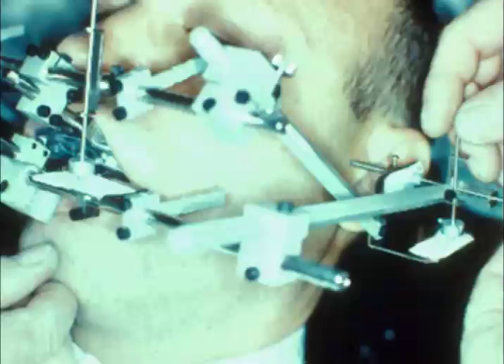The history of recording devices is the pantograph. The definition of a pantograph is two rigid bodies that move relative to each other. The Stewart pantograph was an ingenious system, but it had telescoping styli, so it actually wasn't two rigid bodies that moved relative to each other. But it did have clutches over the teeth with a central bearing screw, and they'd paint the vertical and horizontal graphs here with a chalk-like material.